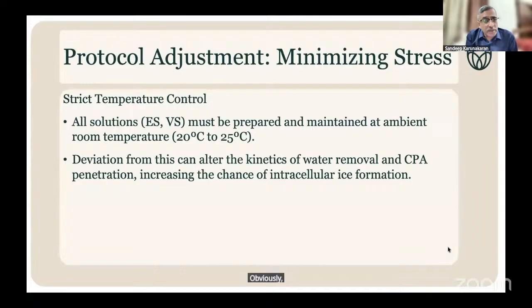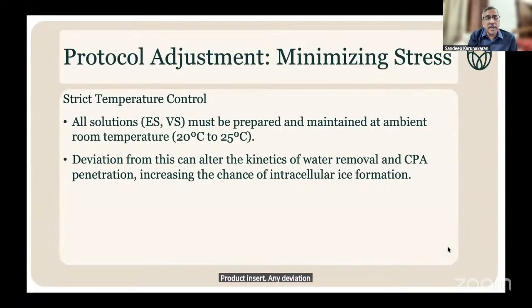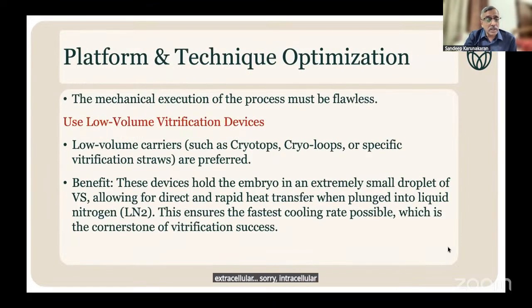Obviously, when you are revitrifying, the solution should be strictly as per protocol as mentioned in the product insert. Any deviation can alter the kinetics of the water movement and the CPA penetration, which would mean there would be increased chances of intracellular ice formation.